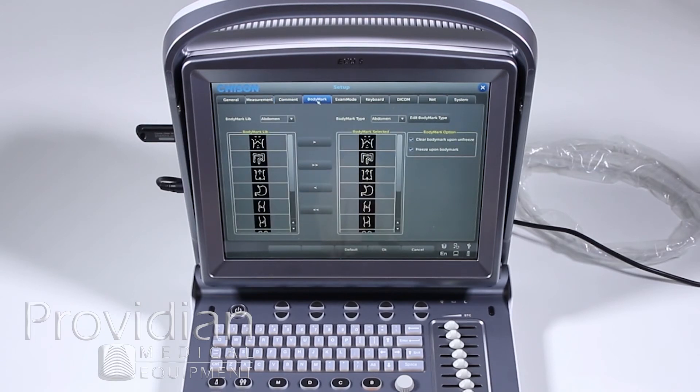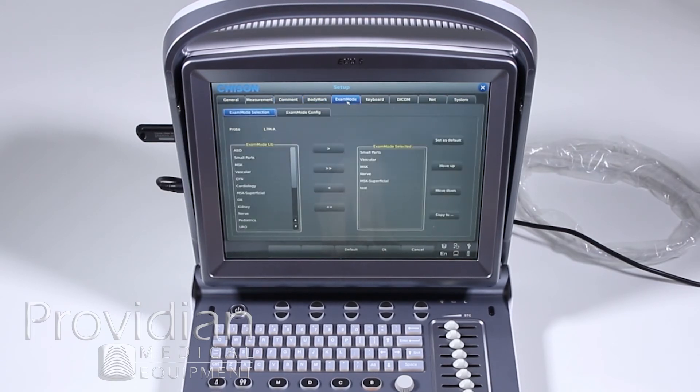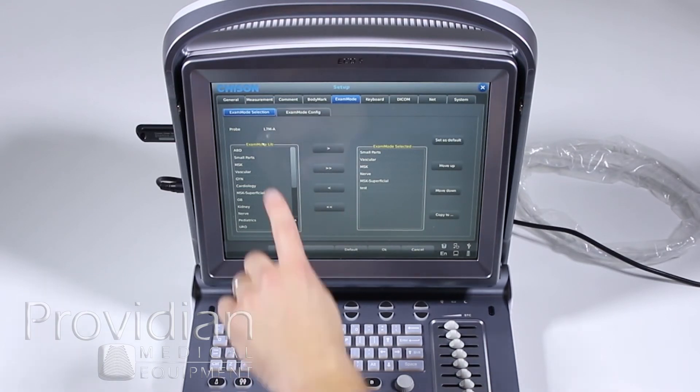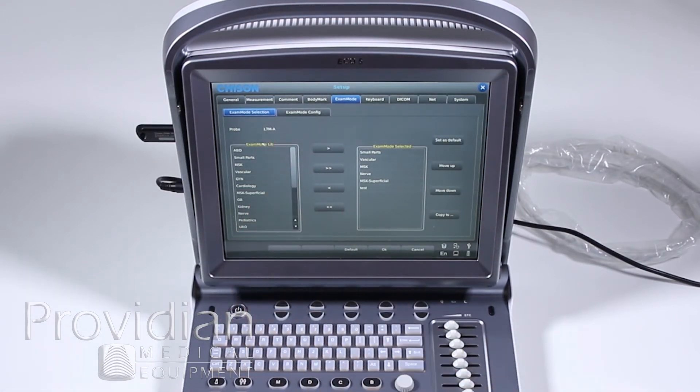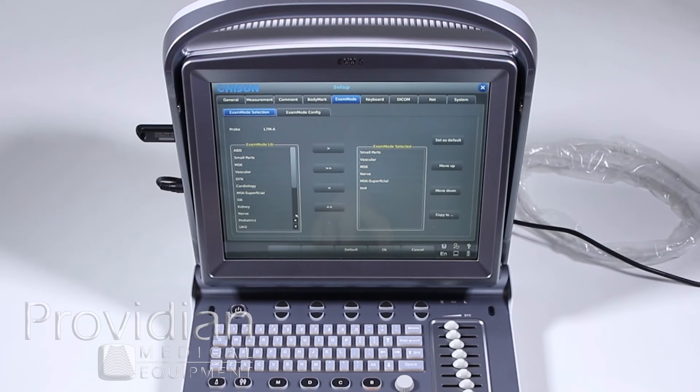So this comment library over here first tells you all the available items that are preset into the system for that particular mode. And then the comment type showing what type of comments you want to pop up when you use that exam type. Body mark works very much the same way. Exam mode. Now, this shows this probe, the L7M is plugged in, and here are all the different imaging packages that can come up when it selects the probe.